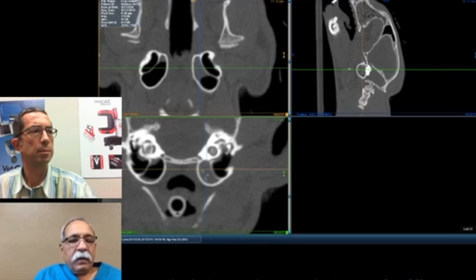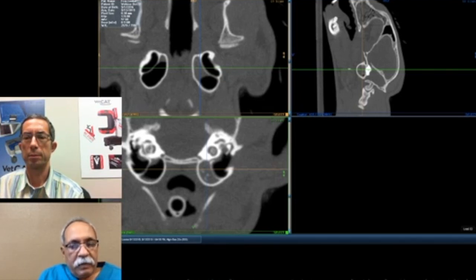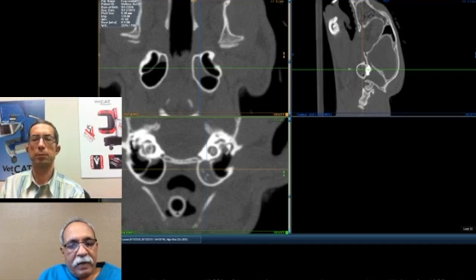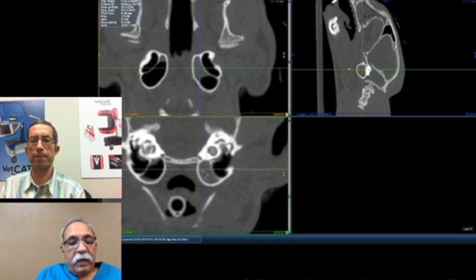So it is a very difficult question to answer because each condition is different. The middle ear structure is, in my opinion, in a medium-sized dog, about the size of an olive. And that has over a couple hundred anatomical structures, and which anatomy is involved is very difficult. And the funny thing is cholesteatoma, talking about just one example, you can have 10 dogs with cholesteatoma, and all 10 dogs are going to respond completely differently.